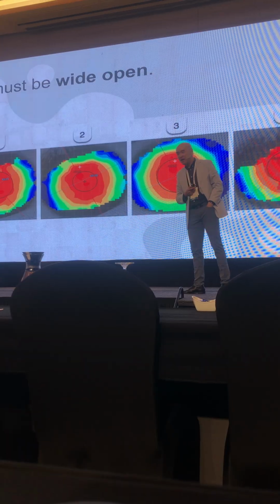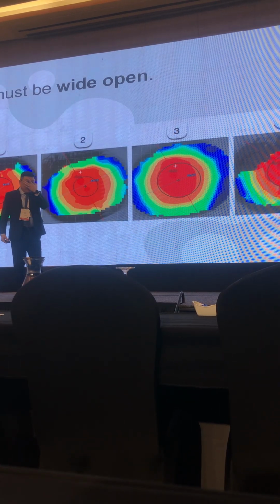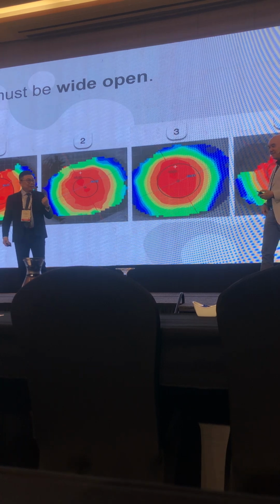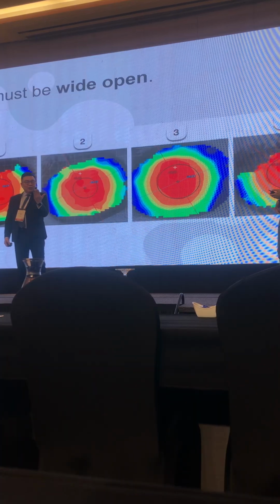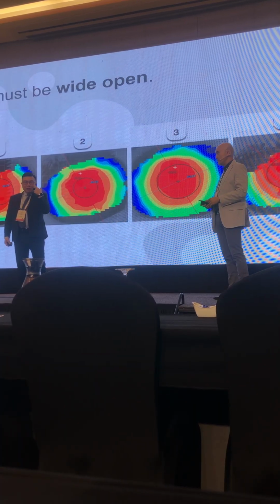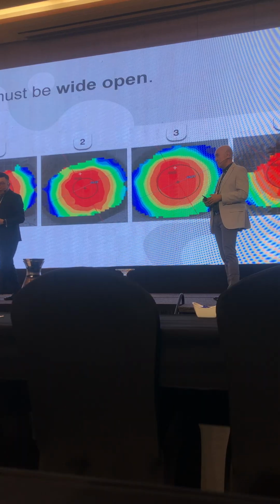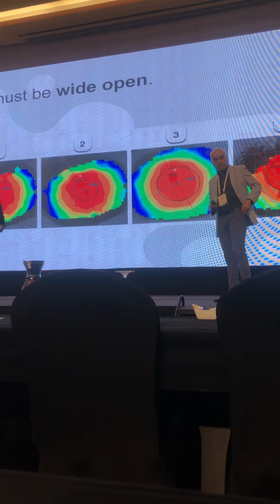Because in my practice, we definitely let them know that before we take them back, no electronic devices for at least 15 to 20 minutes. Even for us, when we look down for 15-20 minutes, our lower lid will push a bit and reshape the lower cornea already. This was done by Professor Colin at QUT.